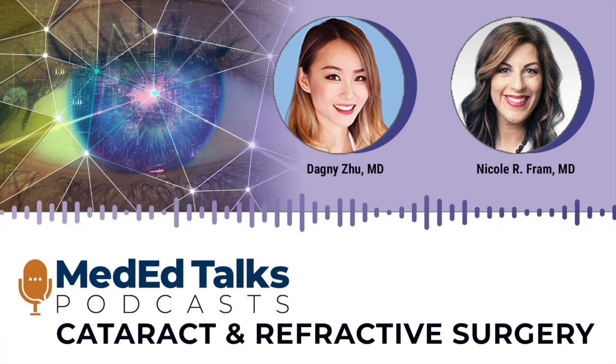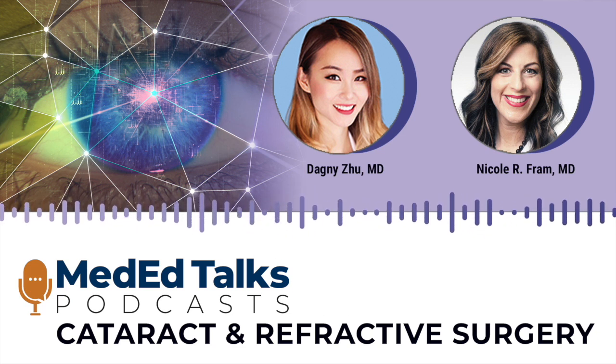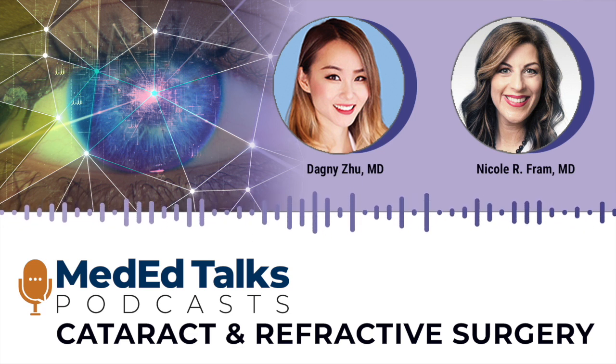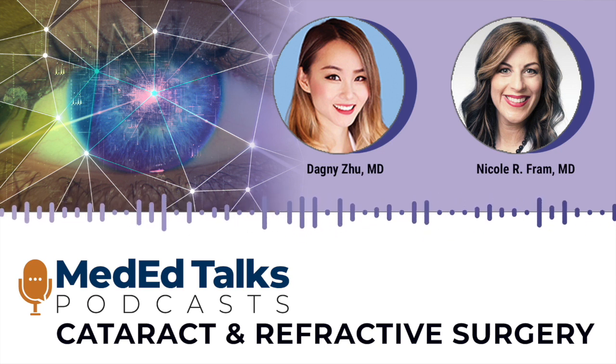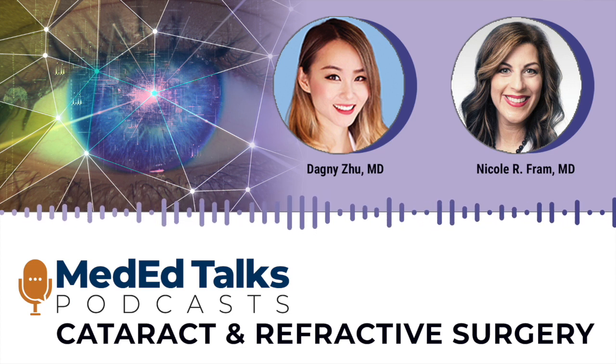So it's a great way for me to search these eyes afterwards and see how I'm actually doing. Now we have new AI formulas and other ways to do this with other software planning systems for cataract surgery, but I still find that intraoperative aberrometry is very useful in my high torics and post-LASIK patients.